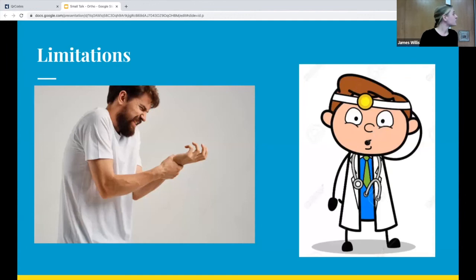So limitations for ultrasound, the main limitation is pain. Putting direct pressure on a really painful extremity injury, and it being a fracture, can also prevent you from getting a good exam. The water bath is an alternative technique to help mitigate that, but obviously that's limited by the location of the fracture.